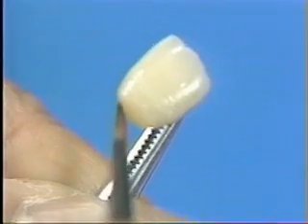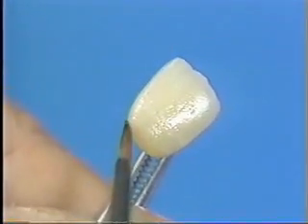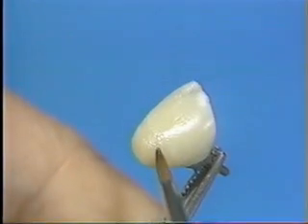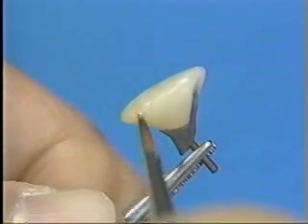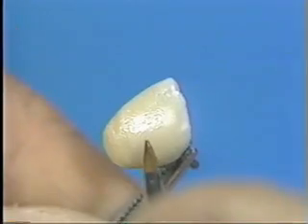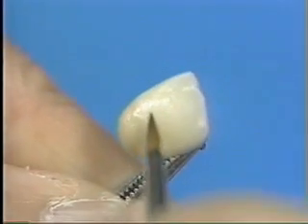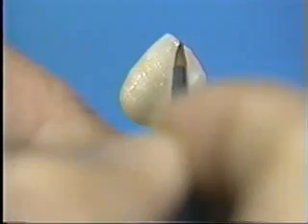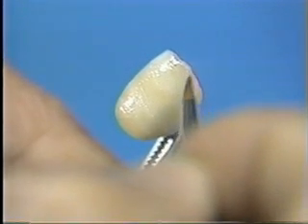Coat the cervical with a mixture of cervical 1 and cervical 2 at a ratio of 1:1. Apply cervical 1 between the white lines slightly. If necessary, paint the cervical 1 onto the middle 1/3, which will emphasize the white line appearance. Paint cervical 2 from the incisal and extend to the lingual surface.